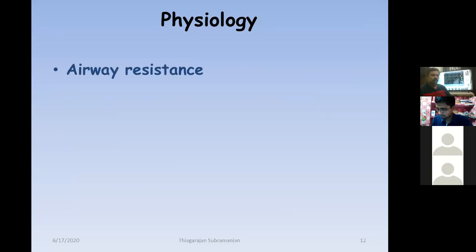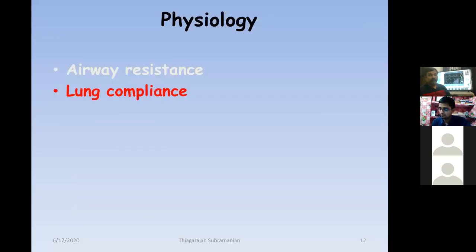We are going to talk about airway resistance, which can be referred to as the force encountered during the mechanical cycle, and normally 5 cm of H2O is the reference. Compliance is simply the elasticity of the lungs, like a rubber, which can expand to accommodate the change in lung volume under pressure. With low lung compliance, it is very difficult to achieve inhalation pressure. A person who struggles with expansibility is said to have stiff lungs. Poor compliance would be seen in pulmonary fibrosis.